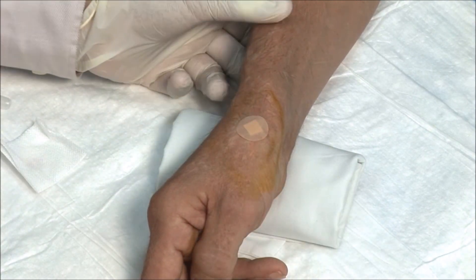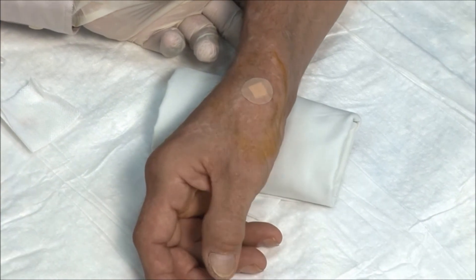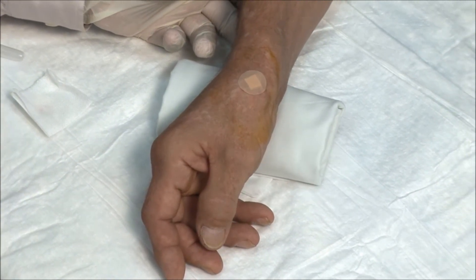Ask the patient to flex and extend the thumb. Pain relief can be almost immediate.